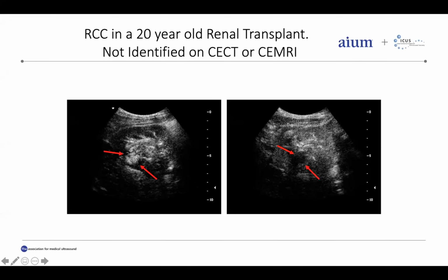And at that time, I was hounding people to send us cases for our research studies. And this patient came to us, and lo and behold, when we injected our ultrasound contrast, there was a markedly enhancing lesion in the arterial phase before even the kidney, which only lasted for about 10 seconds or so, and then became relatively iso-intense. And again, this is why you couldn't see it on CT and MR. The timing was not appropriate, and it was in the isodense phase. We biopsied this under ultrasound contrast. It was a renal cell carcinoma, and then I ablated it, and here you can see again, no contrast, so we had an adequate ablation.